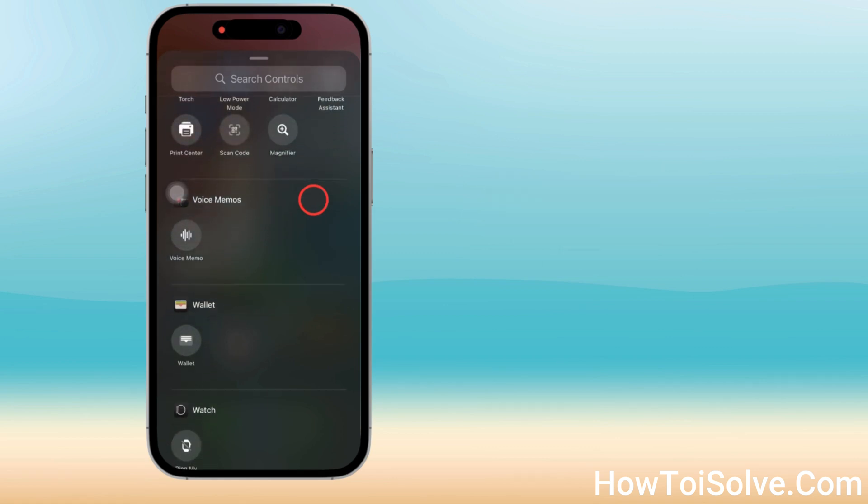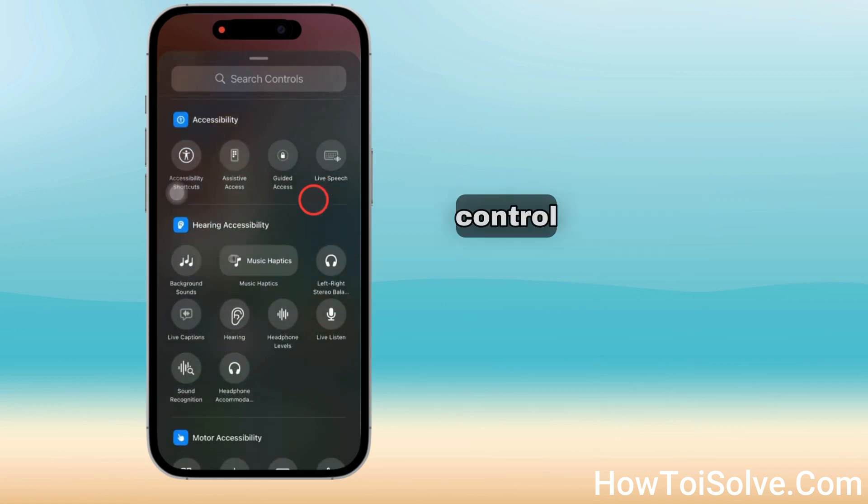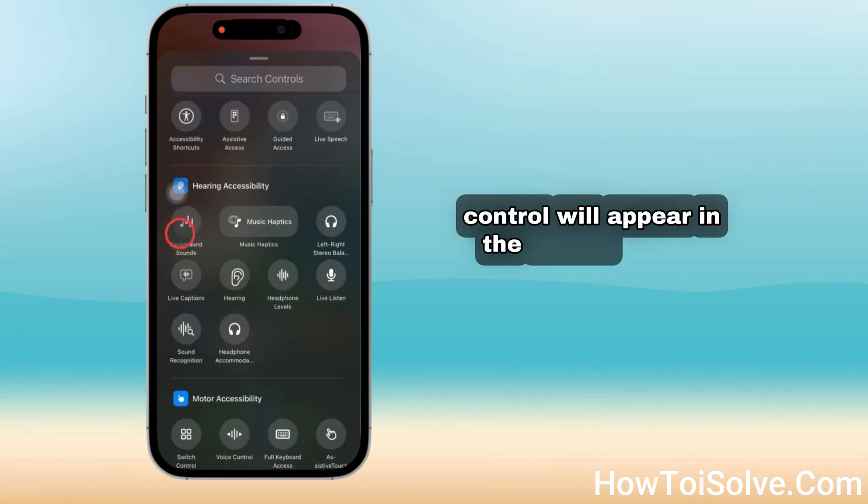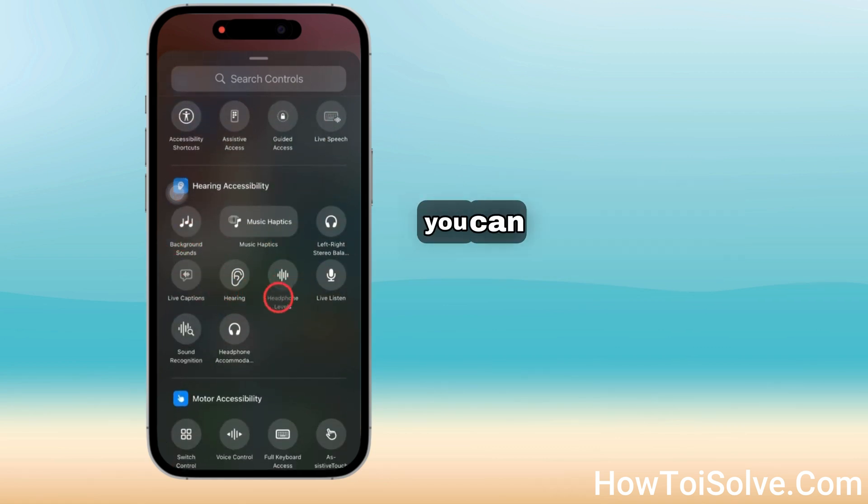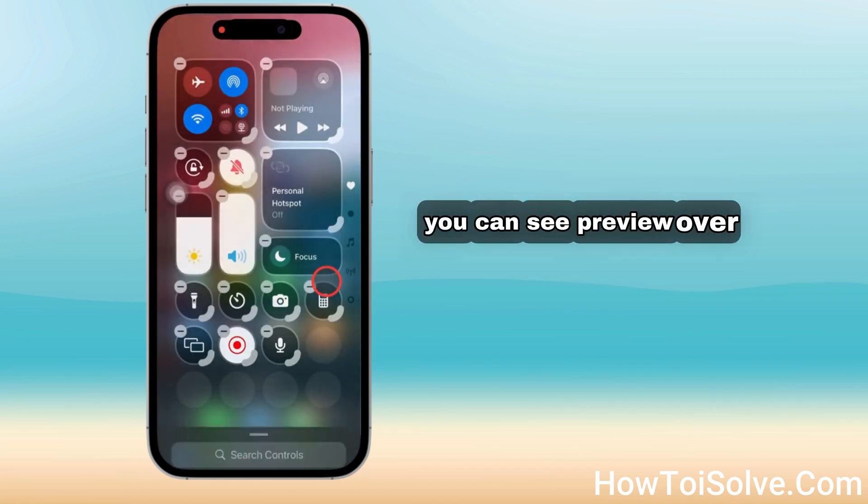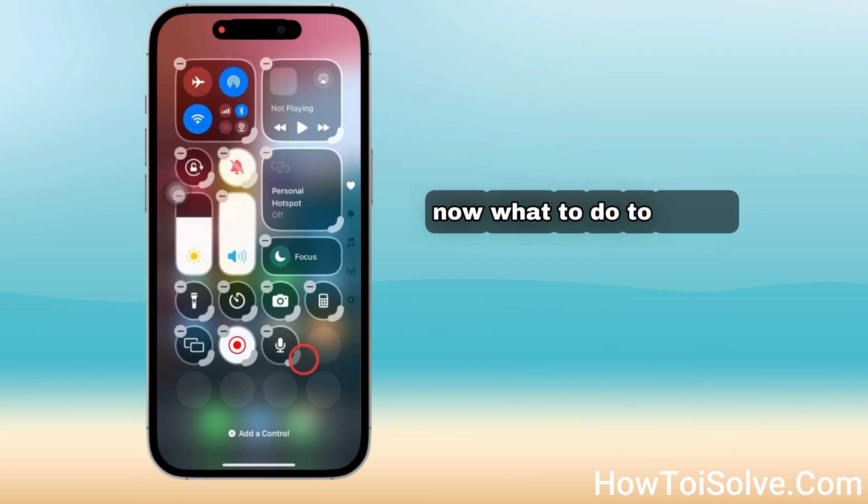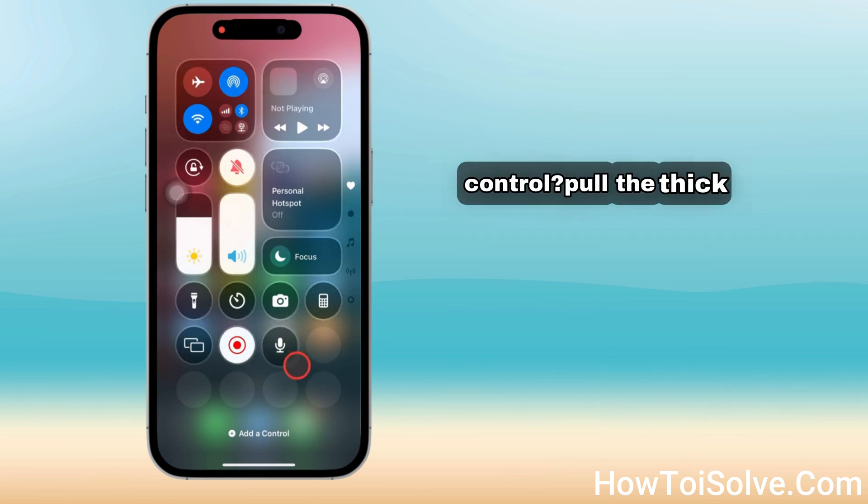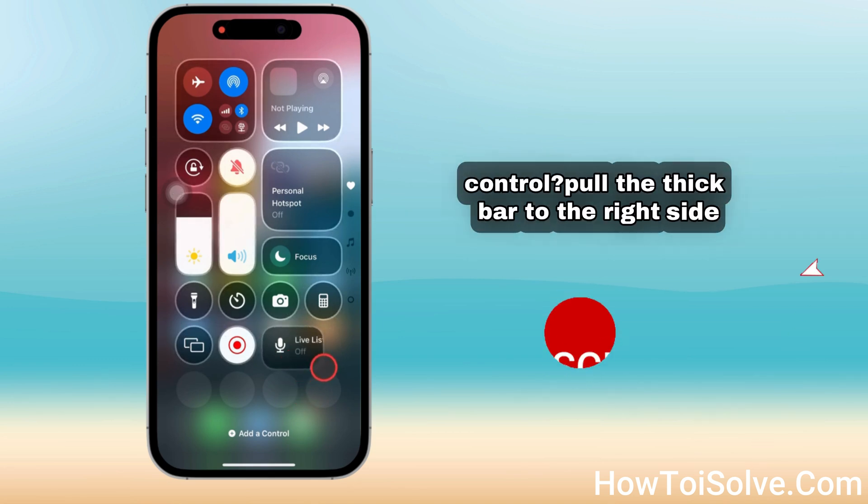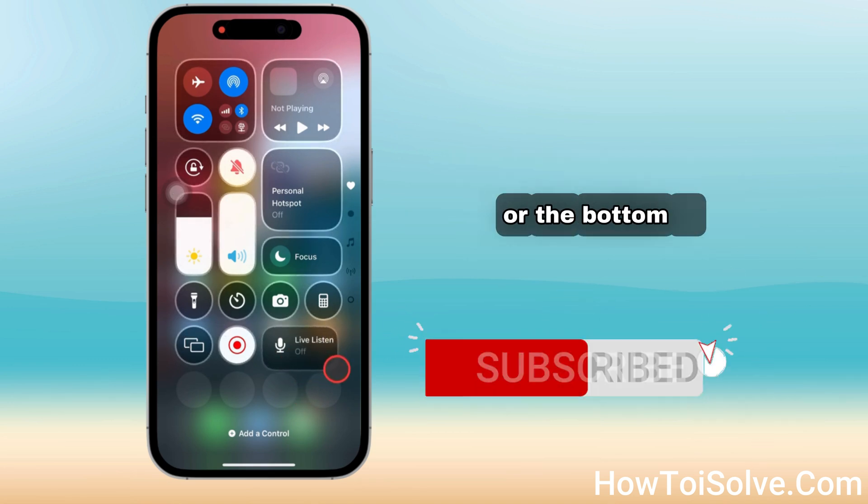Tap on Live Listen so the control will appear in the Control Center. You can see the preview here. Now, to resize the Live Listen control, pull the thick bar to the right side or the bottom of the screen.